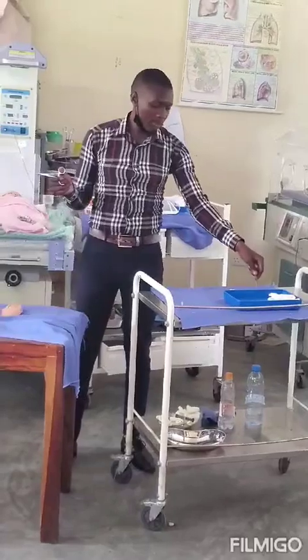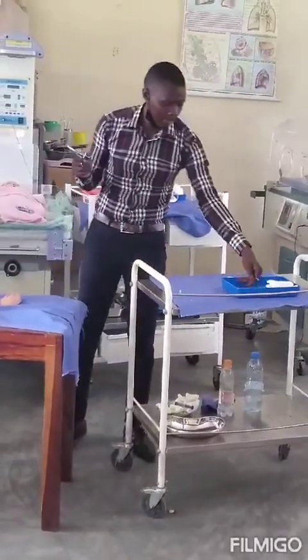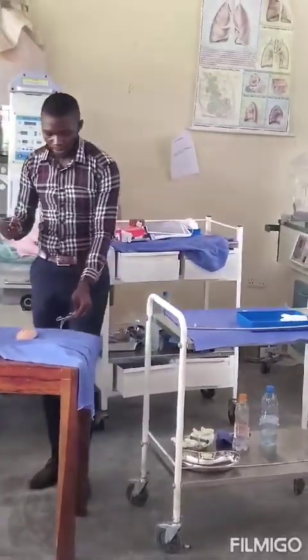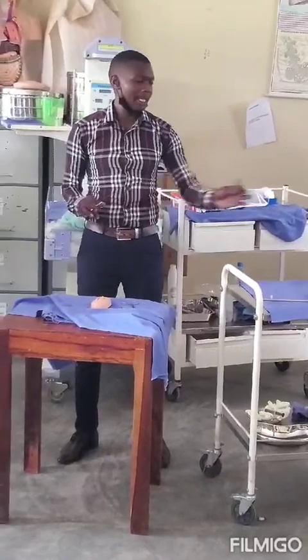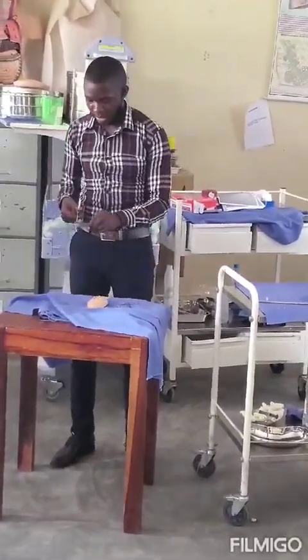Then you are also going to pick the scissors. So let's imagine this is the scissors now remaining here. You are going to pick the scissors like that and drop it on the drape like this, because at this point both my hands have now moved away from the field, meaning I can't go back. So you will now start suturing.